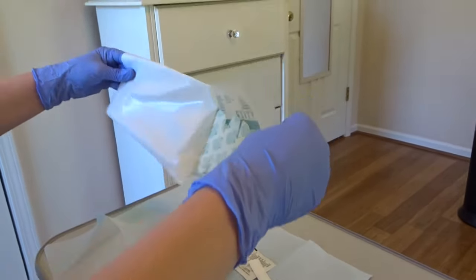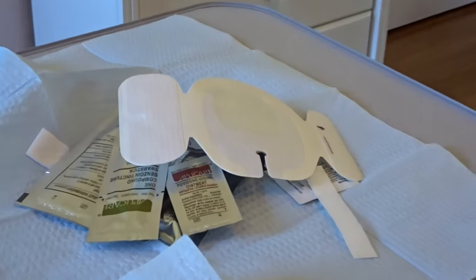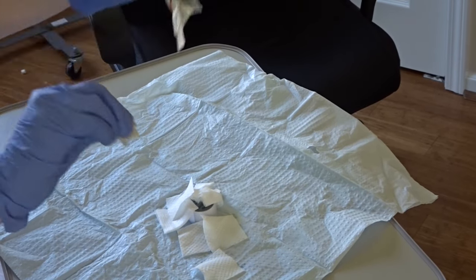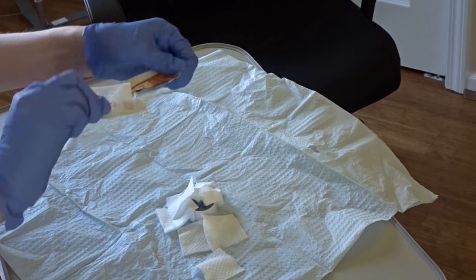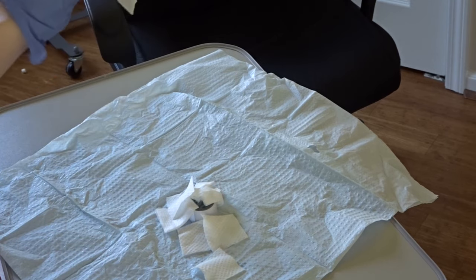If there are extra supplies desired — like a stat lock, a different dressing or cleaner, or a bio patch — open those packages and drop them onto the sterile field without touching them. If there is no one else around to aid the person conducting the dressing change, you also want to rip the various packets of alcohol over the sterile field.